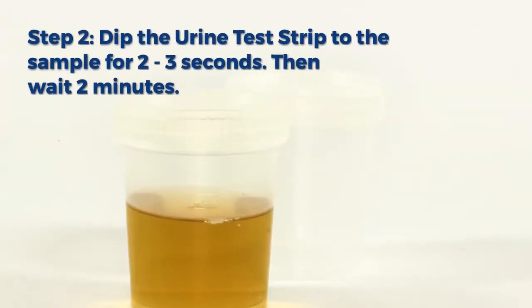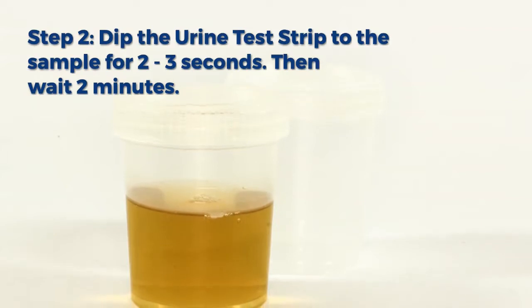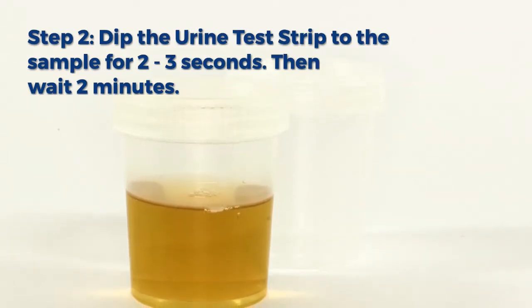Step 2: Dip the urine test strip into the sample for 2 to 3 seconds, then wait 2 minutes.